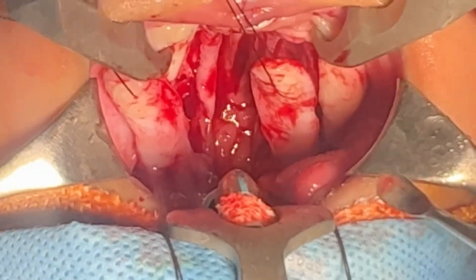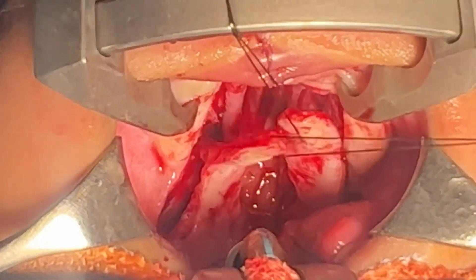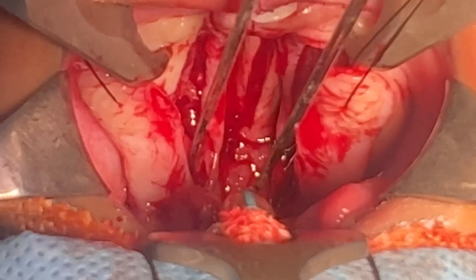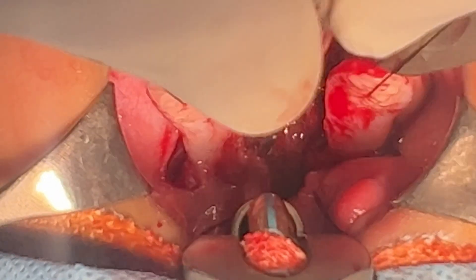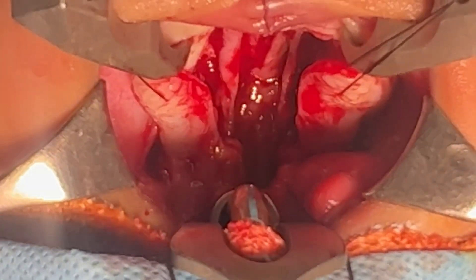Likewise on this side — this would come on top. The most important layer is the muscle layer, all here. You can see the nice chunk of muscle I'm holding on to, and that's going to go down inferiorly so that when the patient speaks there's going to be good movement there, closing the velopharyngeal region.